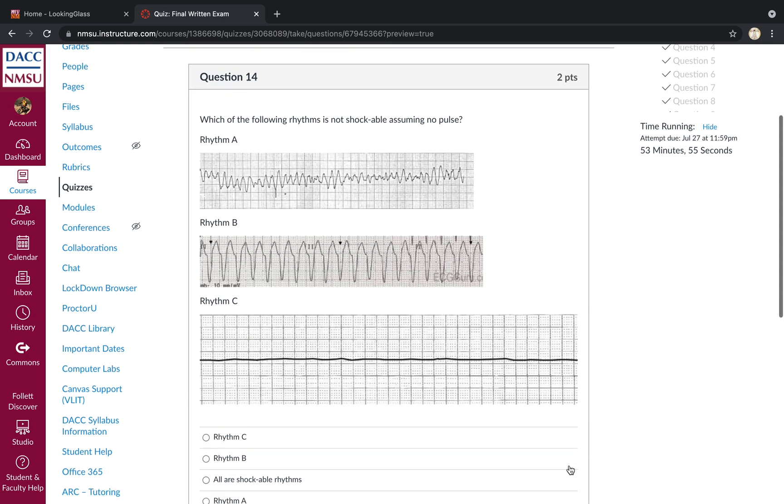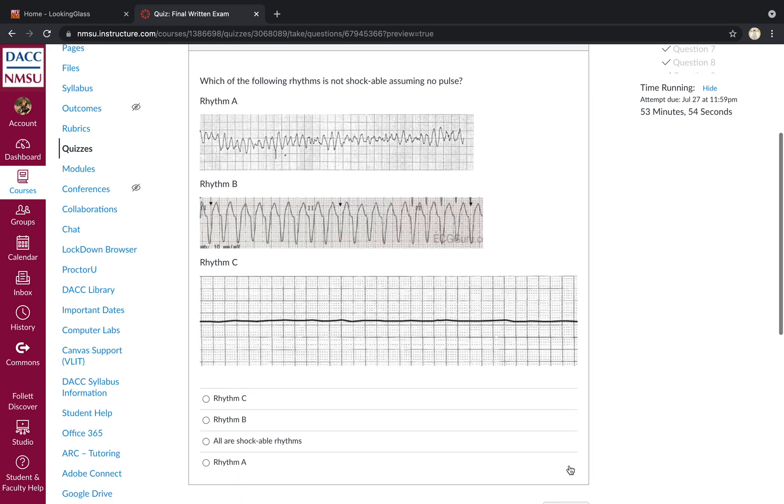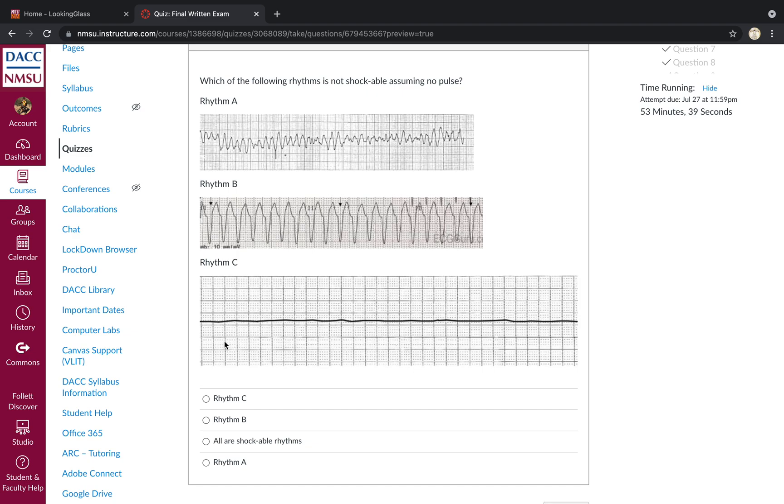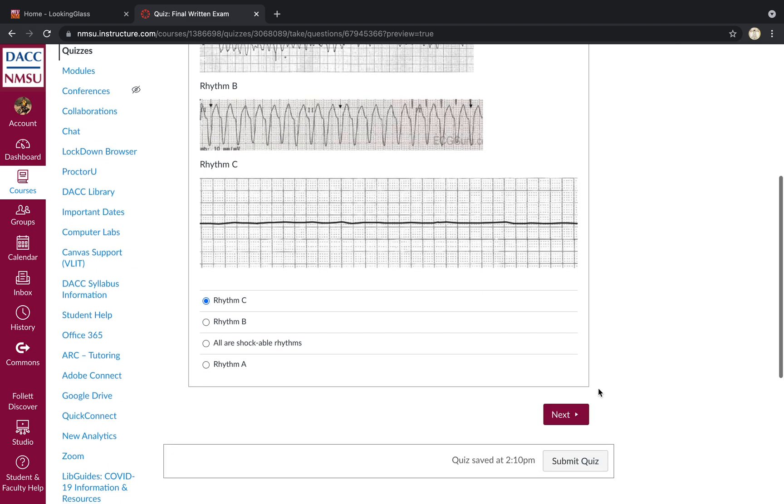Which of the following rhythms is not shockable? Assuming no pulse. So rhythm A is ventricular fibrillation. That is shockable. Rhythm B is ventricular tachycardia. VTAC without a pulse is shockable. Rhythm C is asystole. Asystole is not shockable. So rhythm C would be the answer.